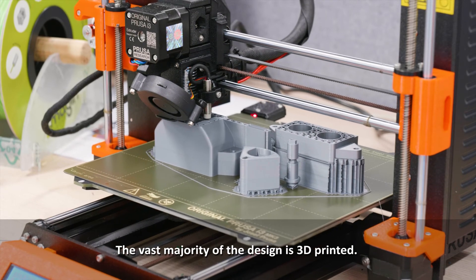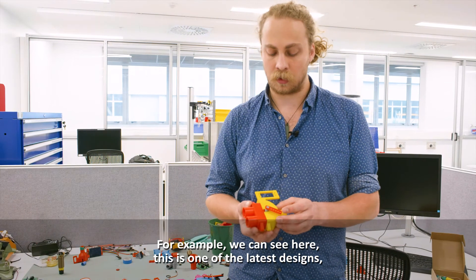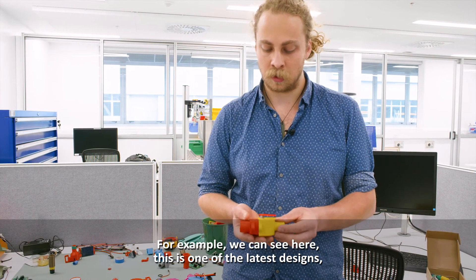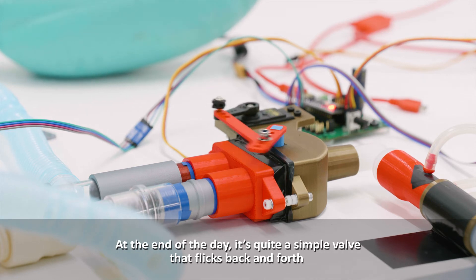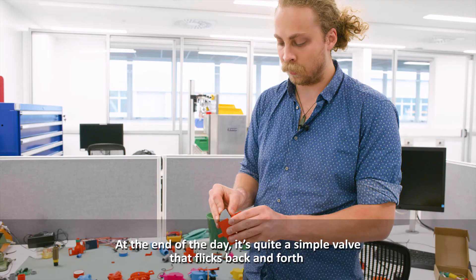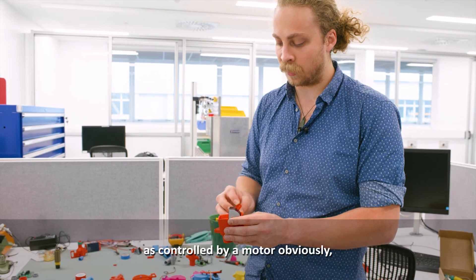The vast majority of the design is 3D printed. We can see here one of the latest designs — there are only really four discrete parts to the valve itself. At the end of the day it's quite a simple valve that just flicks back and forth, controlled by a motor, and directs air down one way or the other.